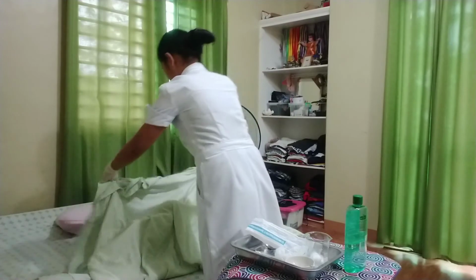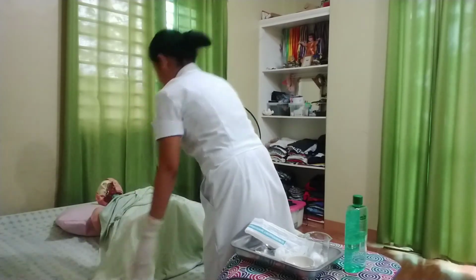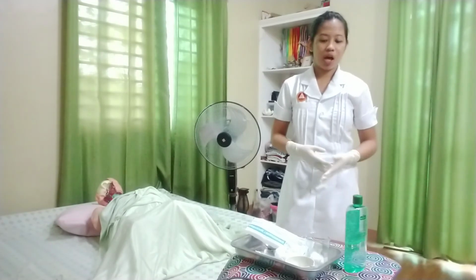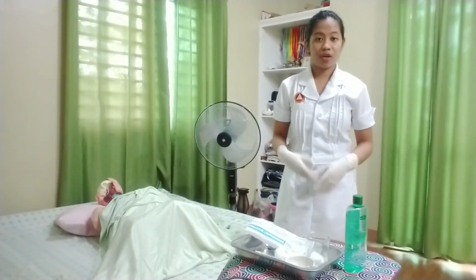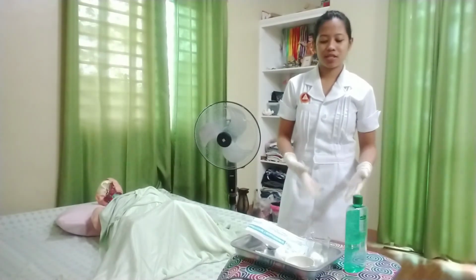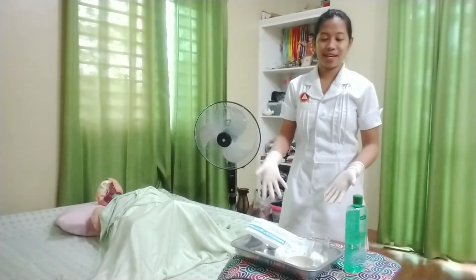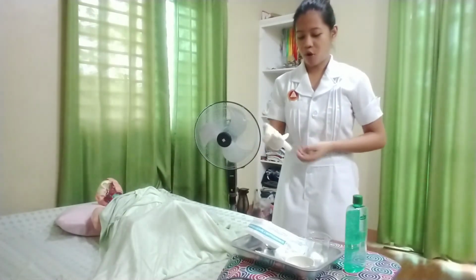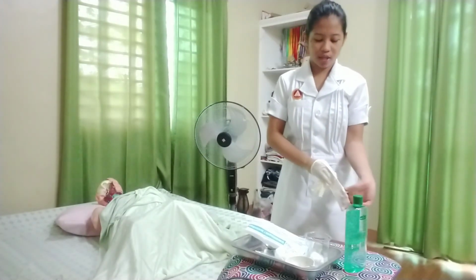So we will put on some blanket, and then after that I will make sure that the equipment is properly stored or disposed of and cleaned. And then I will remove my gloves and perform hand washing and hand hygiene.